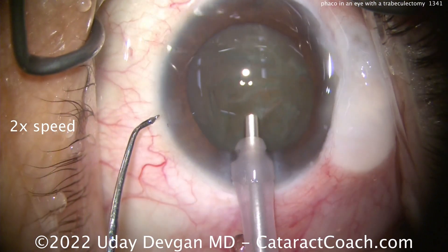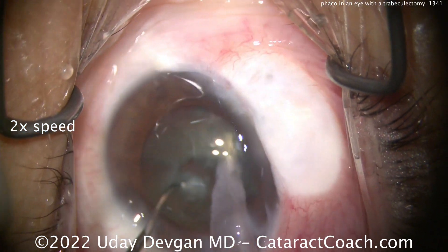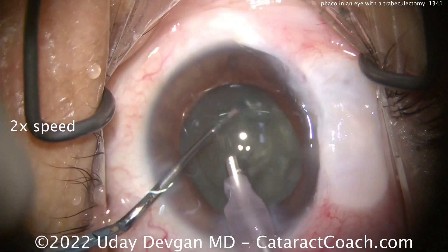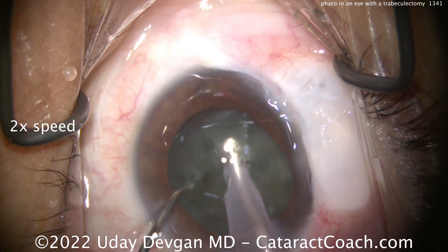Here comes the FACO probe. We've got to be careful on the settings of your FACO machine — you don't want to have a very high infusion pressure. There's the initial vertical chop, and we're using a little bit slower settings here. We're showing you the video at two times normal speed, and not quite getting the chops that I want.